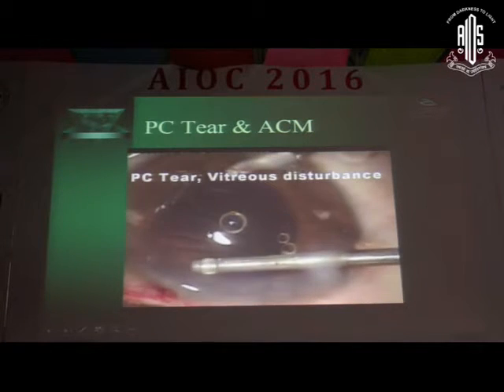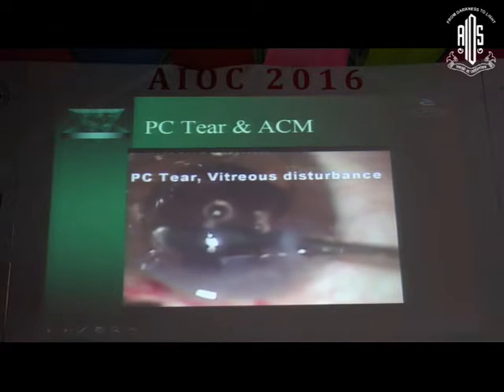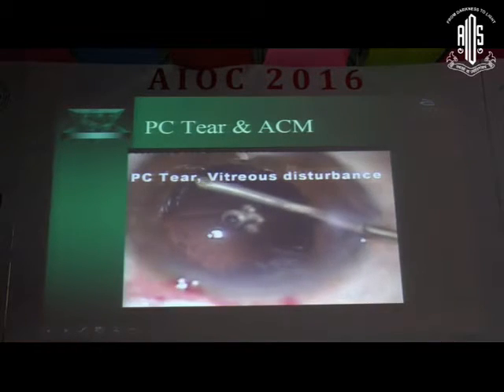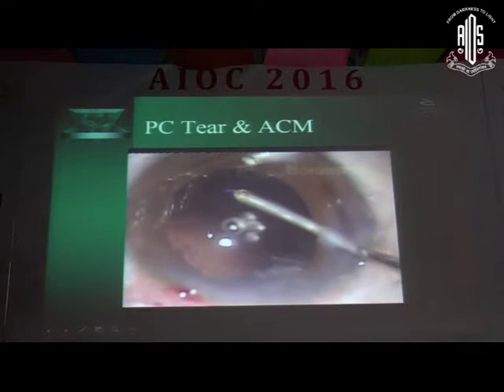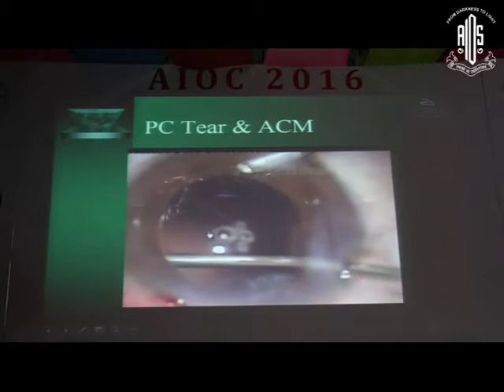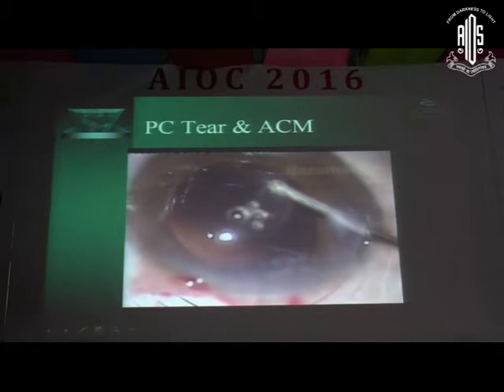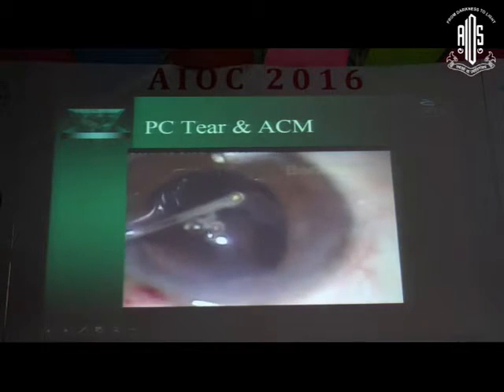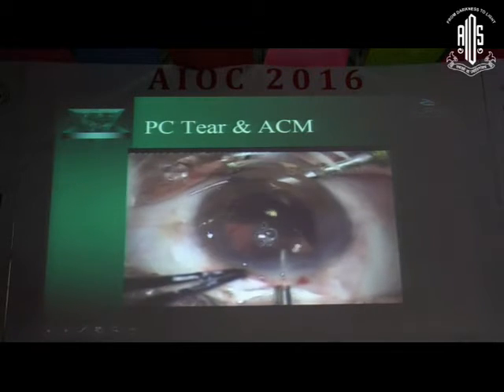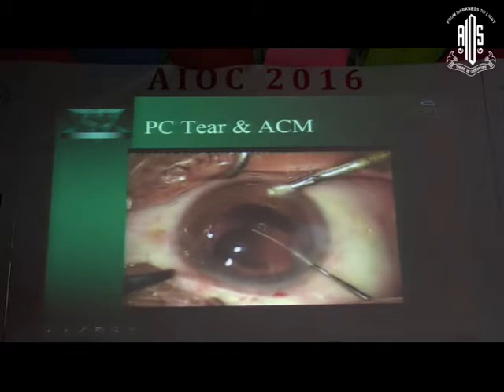Now there is another case where there was a PC tear and vitreous disturbance. I did a closed chamber automated vitrectomy. The vitreous from the anterior chamber was removed. A little core vitrectomy is done. And then gently I could proceed with my regular cortical aspiration. And the anterior chamber maintainer was kept on throughout the procedure because that is continuously suppressing the posterior capsule and the vitreous back. A difficult situation. And after the gentle cortical aspiration, the intraocular lens was placed into the ciliary sulcus.